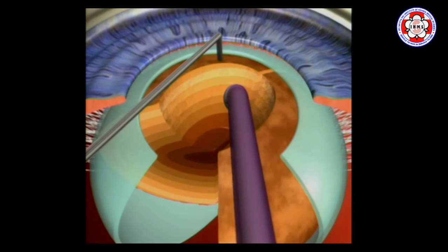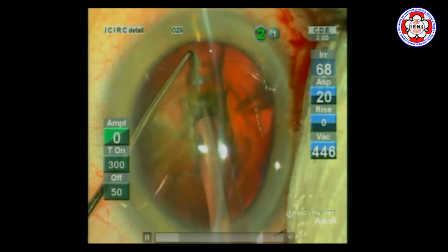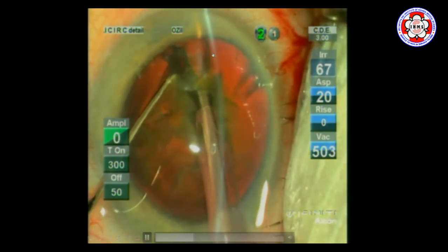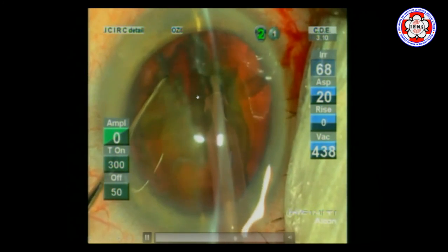This animation highlights the concept well. In the patient with anterior capsular blockade we observed, notice how shallow the anterior chamber is — the slit attachment on the operating microscope confirms this. The moment we chop, the whole chamber deepens because the trapped fluid finds a way out, and then surgery becomes easy to proceed.